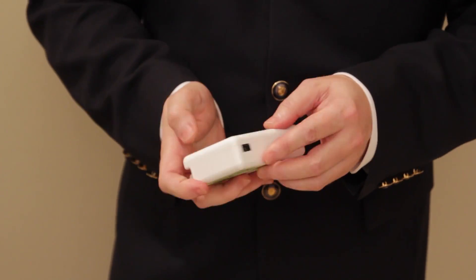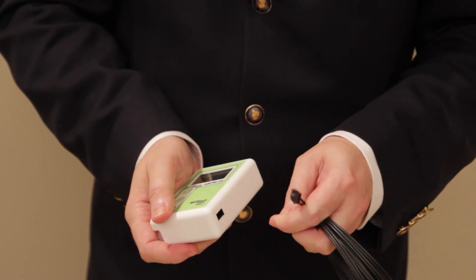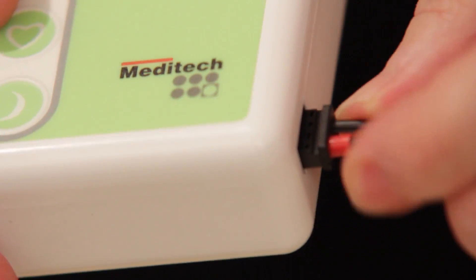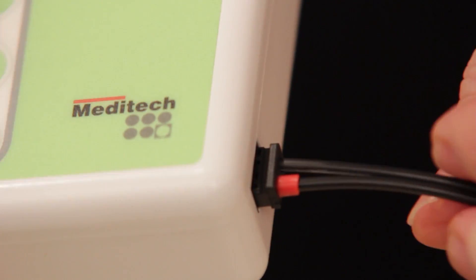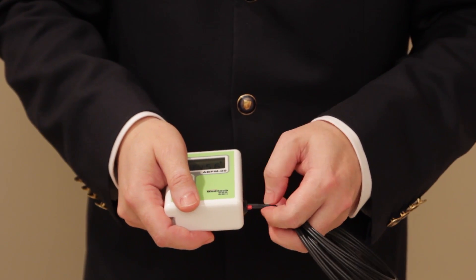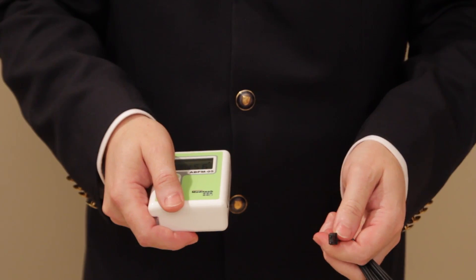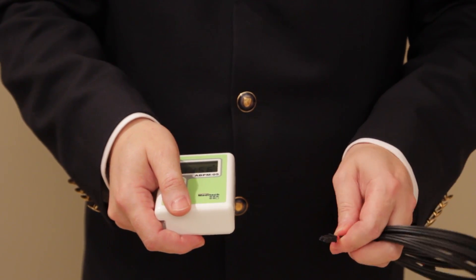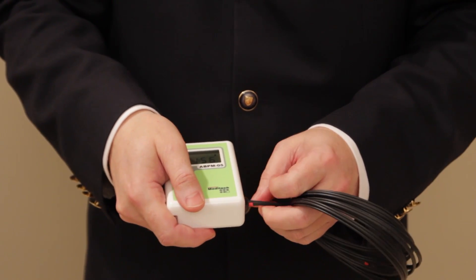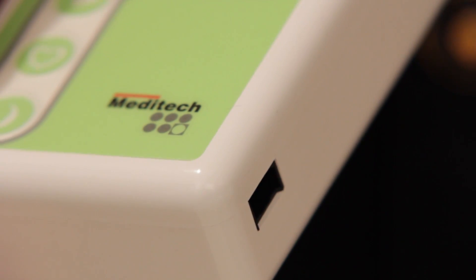To connect the device to the computer, take the end of the cable with the red marker to the edge of the device and push it in until a click. To disconnect the computer cable, do not pull on the cable itself — grab the plug and pull. To summarize: with red down, push until a click to connect; pull on the plug to disconnect.